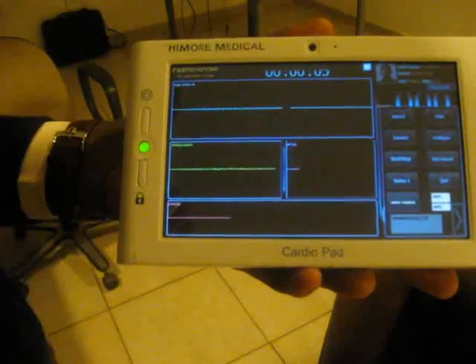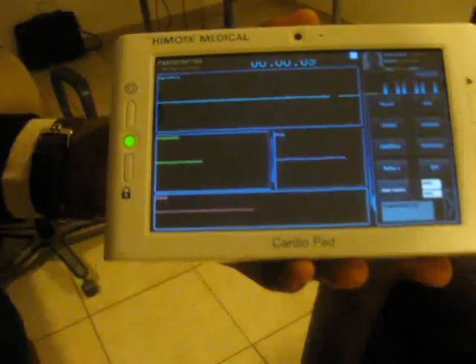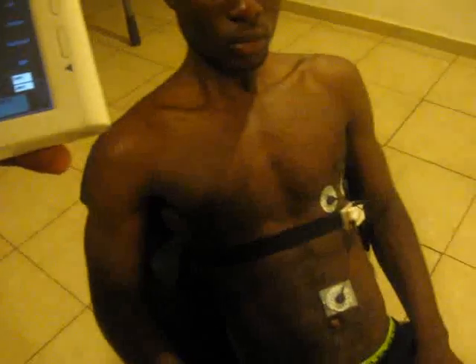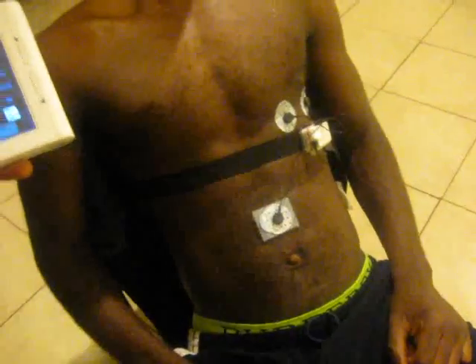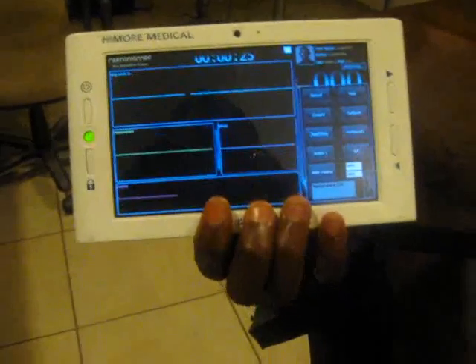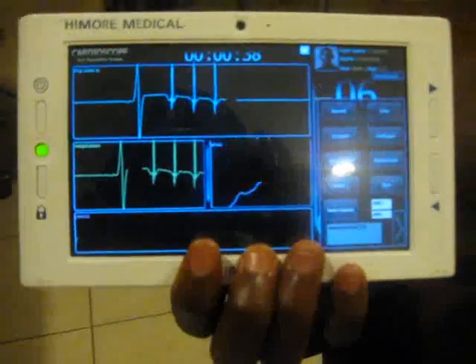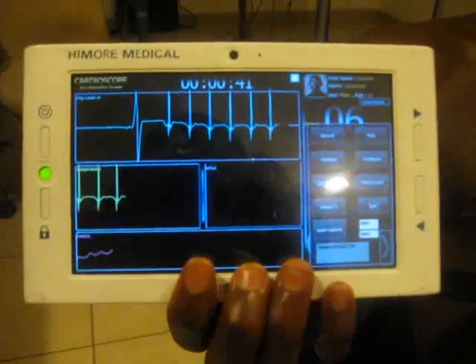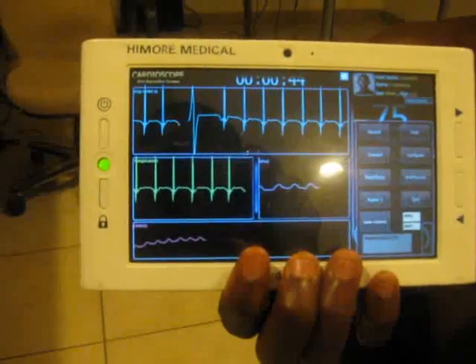Now we can hear a long beep. That means no heart activity has been detected. This is because we have disconnected the electrode from the chest of the patient. If we connect again — if we place the electrode again on the chest — the device detects heart activity. And now you can hear a short beep.